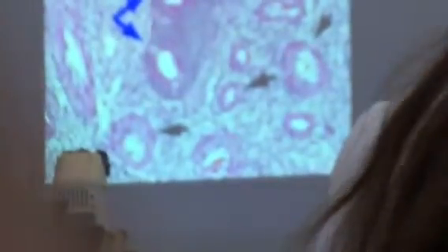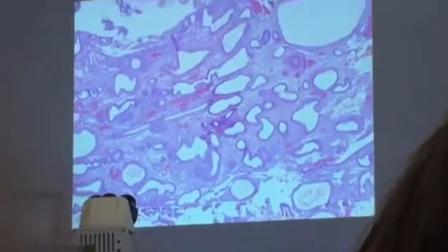Okay? So that's an endometrial polyp. You may not see the shape of the polyp, but that's okay. What is important is to recognize the fibrovascular core. Now, this is hyperplasia. Okay? Now, sa endometrial polyp and again the hyperplasias, proliferative phase is indicated. It's just that in simple endometrial hyperplasia, you get cystically dilated glands. Okay? Kaya simple, no? Hindi siya complex. The shape is simple.